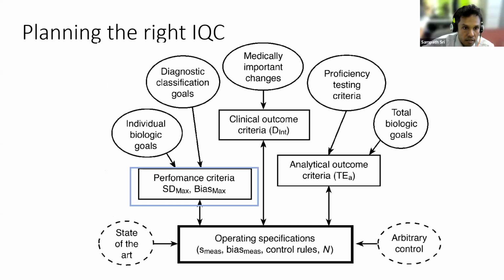Some of these factors like biological variation goals or diagnostic classification may impact the performance criteria of a QC program, and some of these clinical factors like medically important changes affect the clinical outcome of the test, and the others like proficiency testing or the biological goals address the analytical outcome of a test.